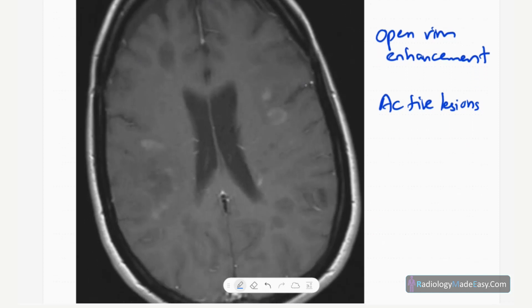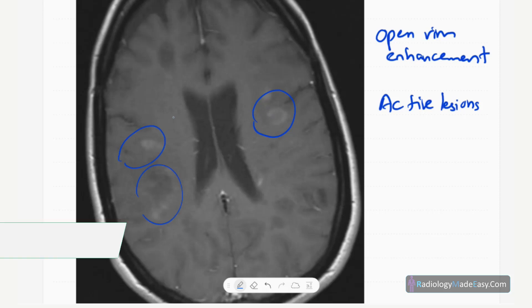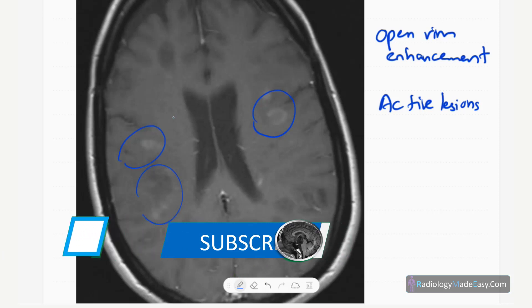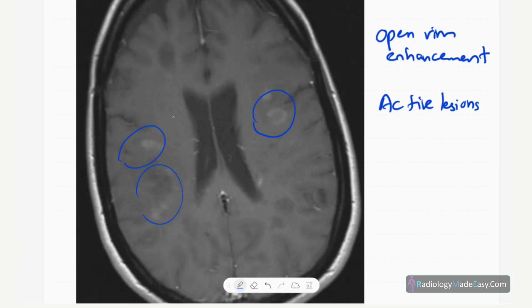On T1 contrast images, you can see incomplete ring lesions. These are incomplete rings that usually face the cortex, so the enhancement is more seen on the white matter side. These are active lesions in multiple sclerosis — we call this open rim enhancement.